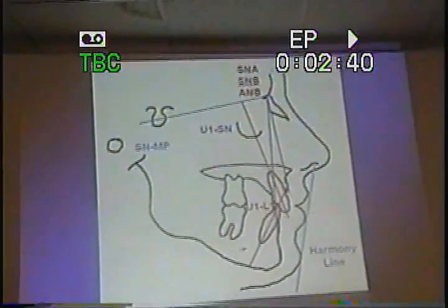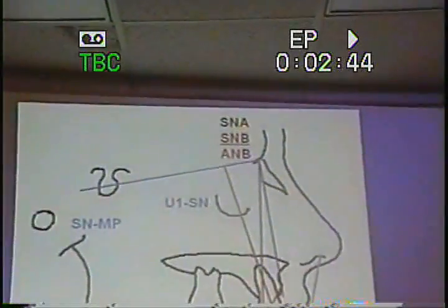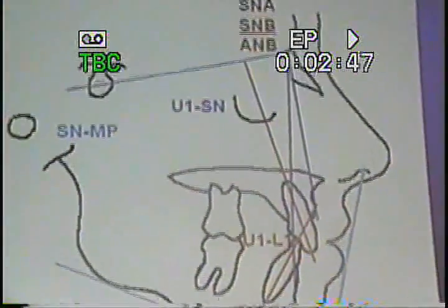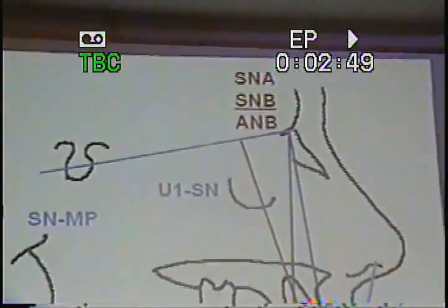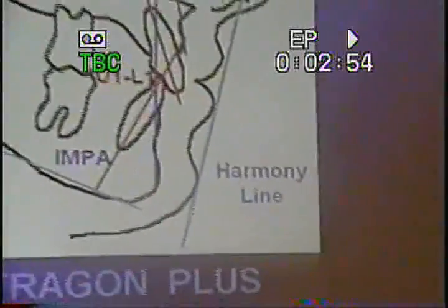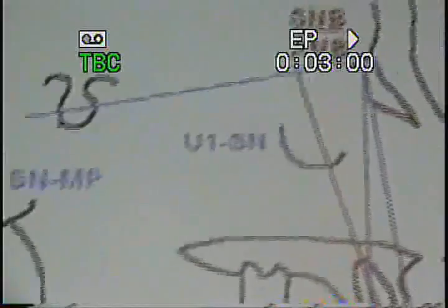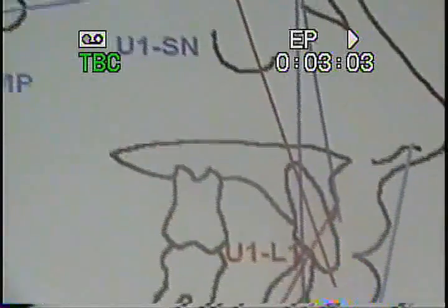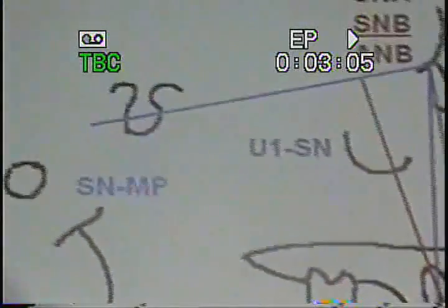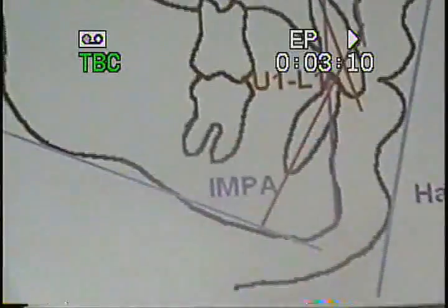this is what I need to diagnose a case. Now I know at school you guys measure everything in the world, and you have all these programmed analyses that print out all these measurements, and all those things are great. Again, being old-fashioned, you give me this information, and I think I can pretty well diagnose the case the way I think it should be. I'm going to go through each one of these now and describe them to you.